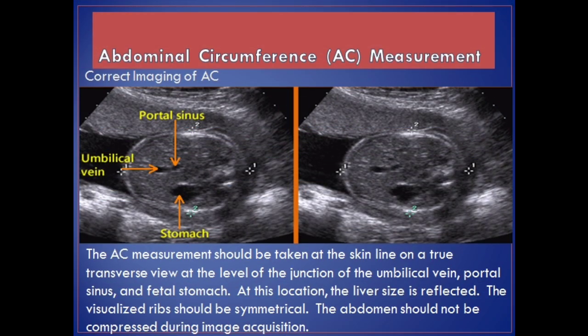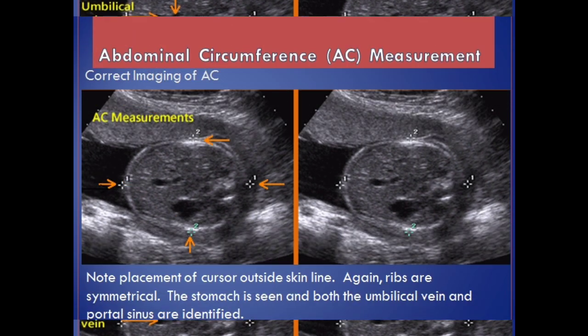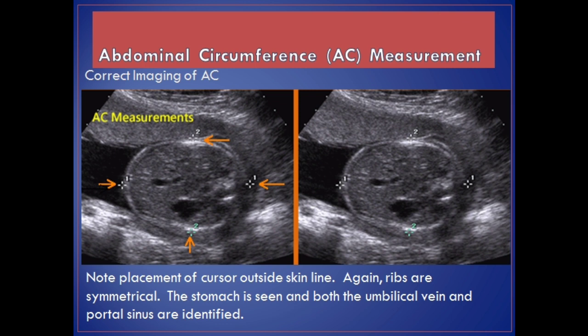Abdominal circumference, AC, measurement. The AC measurement should be taken at the skin line on a true transverse view at the level of the junction of the umbilical vein, portal sinus, and fetal stomach. At this location, the liver size is reflected. The visualized ribs should be symmetrical and the abdomen should not be compressed during image acquisition. Note placement of cursor outside the skin line. The stomach is seen and both the umbilical vein and portal sinus are identified.